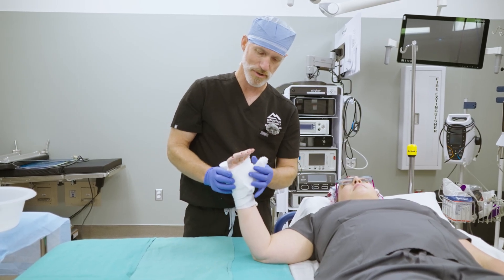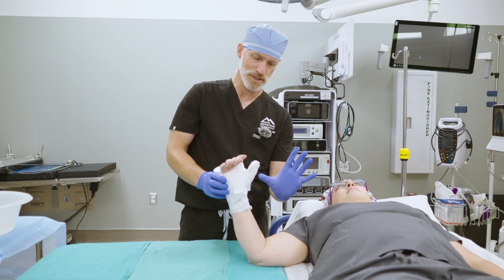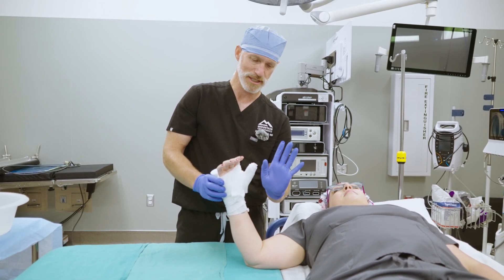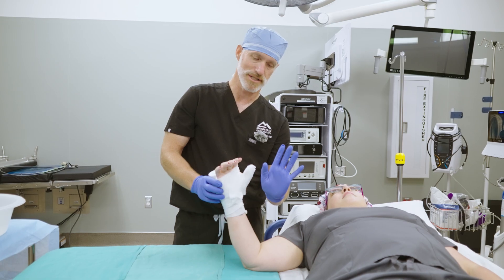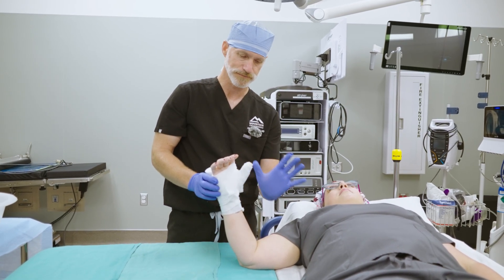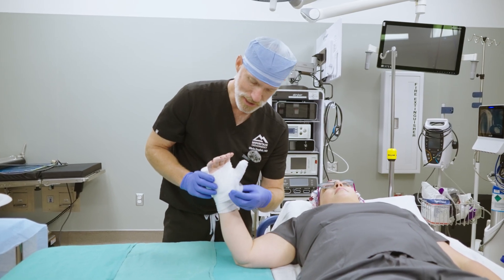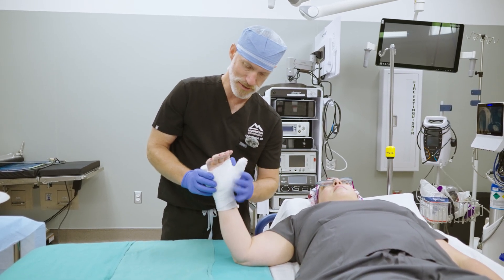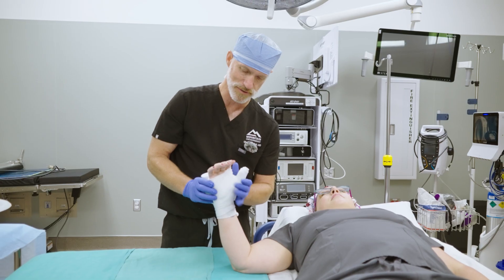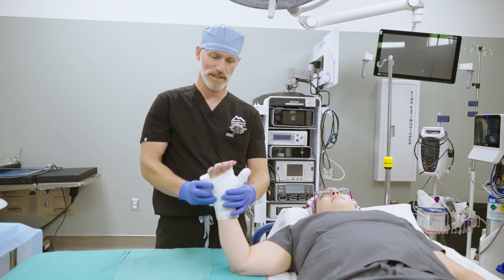Most of the time we want the thumb in an out position. I don't want the thumb splinted in like this because it may get stiff in that position. So I want to pack a decent amount of padding through here to open up the thumb and keep it in an open position. I like to use the padding to do that because it's nice and soft. You can see how Jen's thumb is nicely out there because of all the padding packed in.